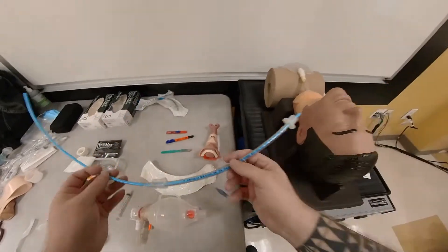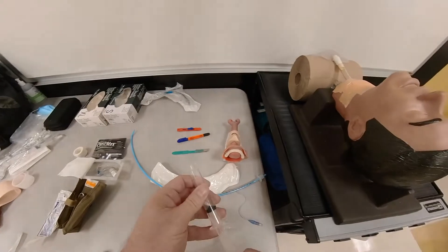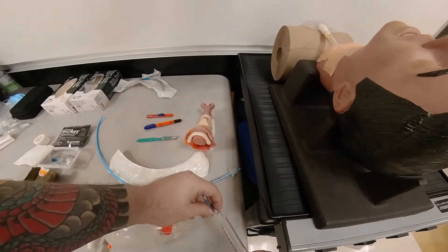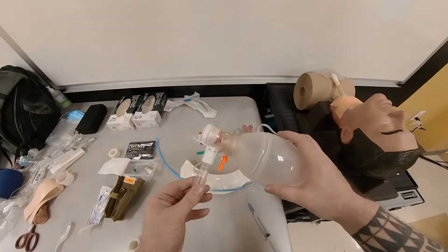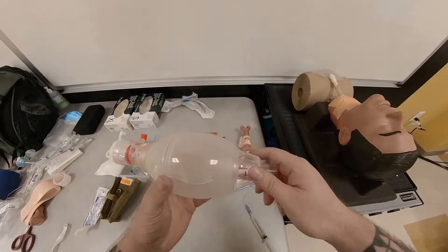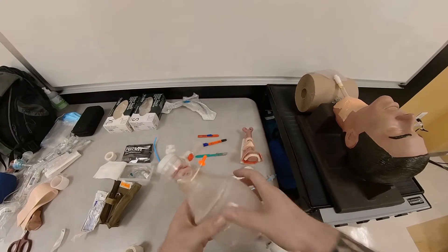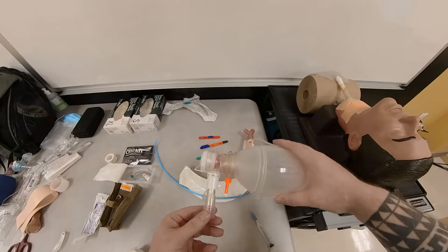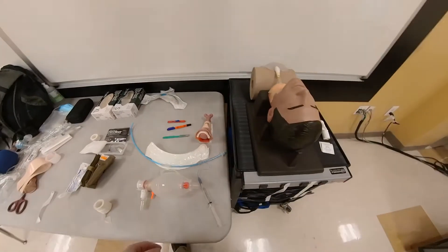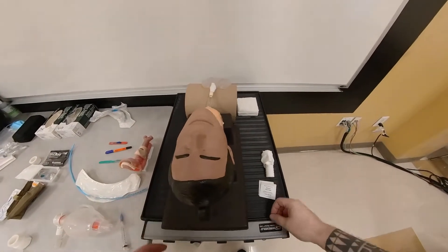I've already pre-threaded my endotracheal tube — we're going to use a 6.0 in this case. You can connect your 10cc syringe to inflate the cuff. You're going to need a BVM — here I have an end-tidal CO2 detector. Notice that I'm using a pediatric BVM, because even for an adult patient, you don't need to empty the bag when squeezing them. End-tidal CO2 confirms that your tube is in the correct location. A contraindication for this procedure would be the inability to find your landmarks.